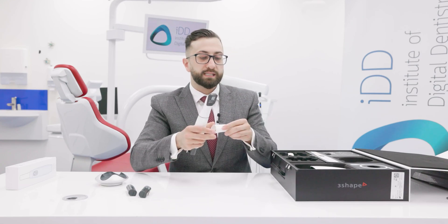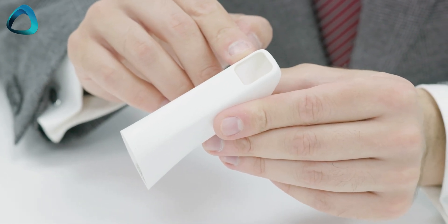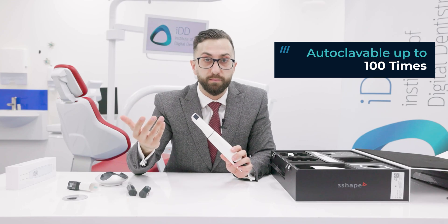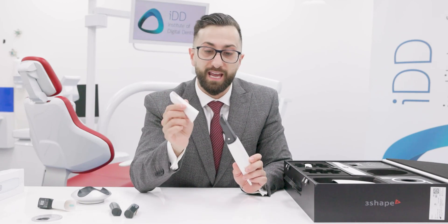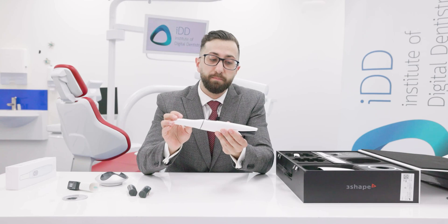Here are the scanning tips for the Trios 5. Just like every other 3Shape scanner, they slide on. The company has opted for a completely closed design — a big push to be more hygienic, with no openings or vent holes where bacteria can live. These scanner tips can be autoclaved up to 100 times. Unlike the Trios 4 smart tips, these are just standard scanning tips. They feature sapphire scratch-resistant glass and can only be placed in one direction — not reversible — clicking on and off.